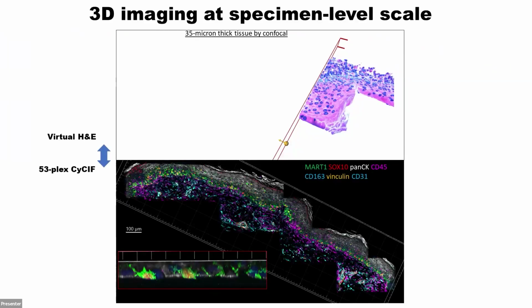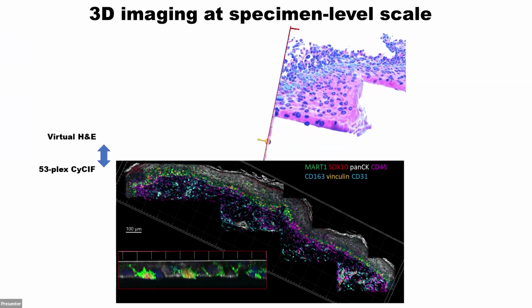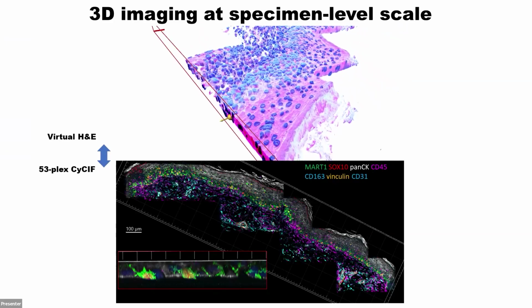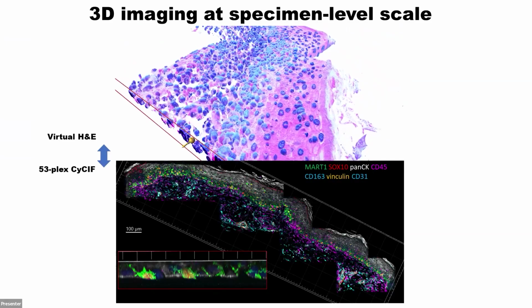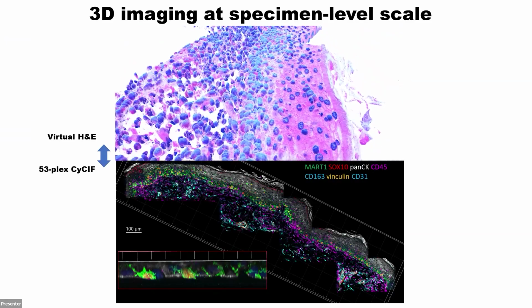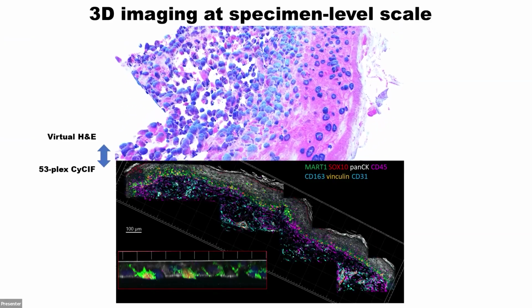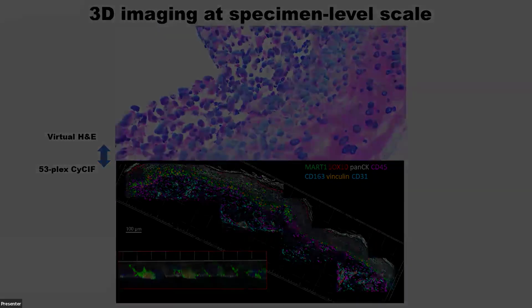And so let's apply this to our favorite melanoma sample. It should be pointed out that in the virtual H&E image, all cells are now more visible with some contrast, even if we did not have a specific stain for those cells. And the way we detect cells in fluorescence, on the other hand, is by being deliberate with our antibody choices. Otherwise, this cell type would be invisible.